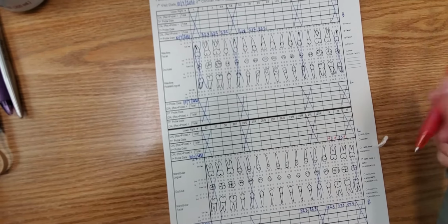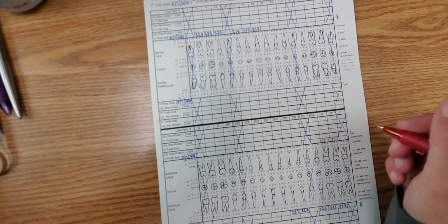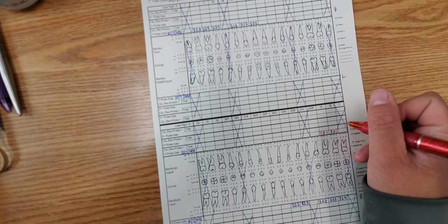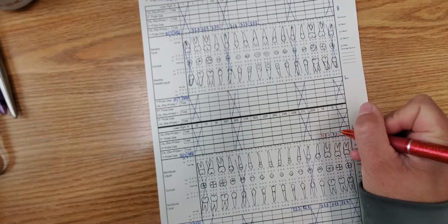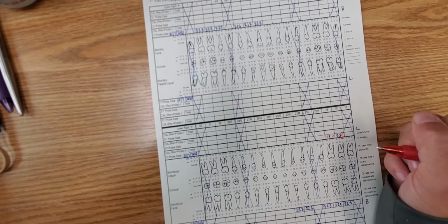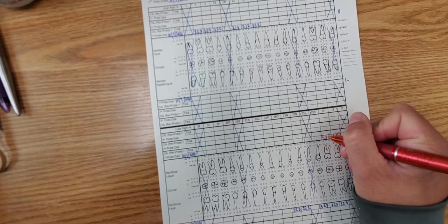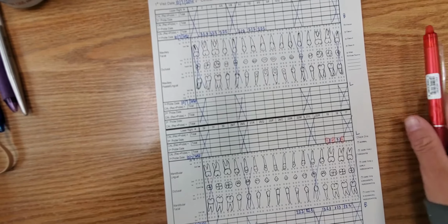You'll also be calling out bleeding. Bleeding should be charted by circling the number. So you would want to call out to the person recording for you, I have BOP on the distal lingual of tooth number 18. That would signify the person charting for you to circle that number. If we say there's bleeding, distal and mesial, tooth number 19, we circle those two numbers.